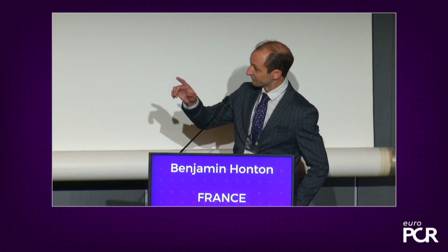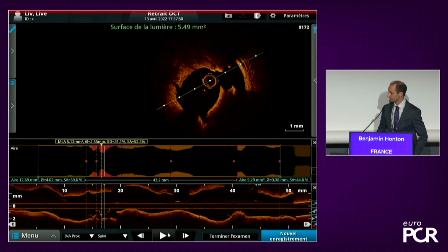It's an important question. Regarding the pullback of the OCT, I think we have well prepared the lesion. There is a limited lumen gain, which is important. This image is important for the flow because we have some characteristics that you mentioned, these fractures. If you don't have any fracture, it doesn't mean that it doesn't work, because you have microfractures. But according to the pullback, the preparation is enough to stent, actually.